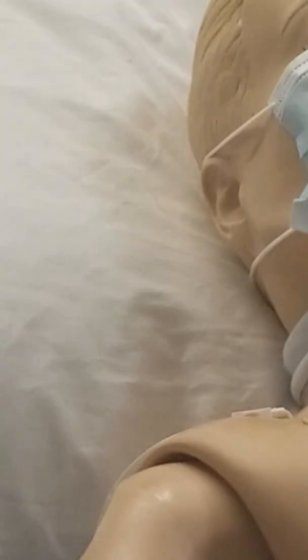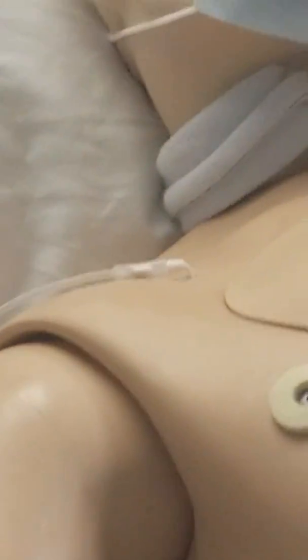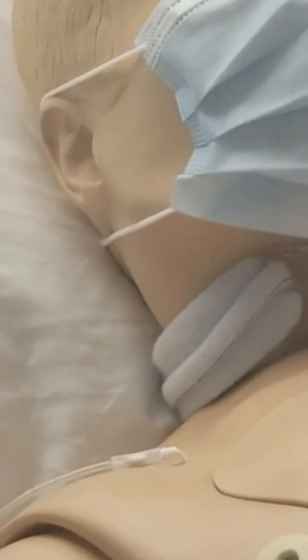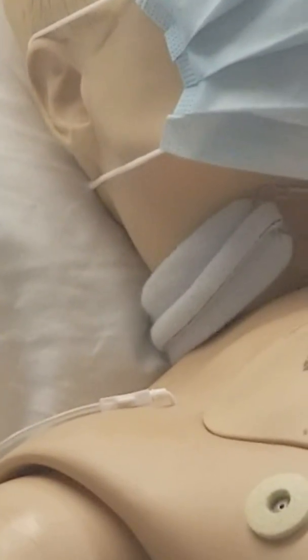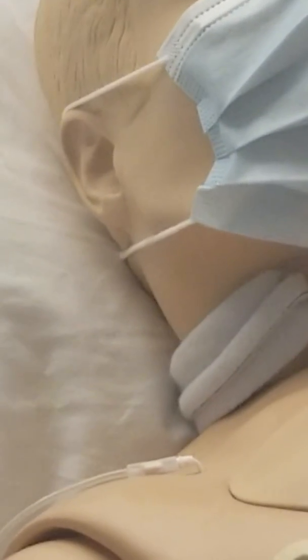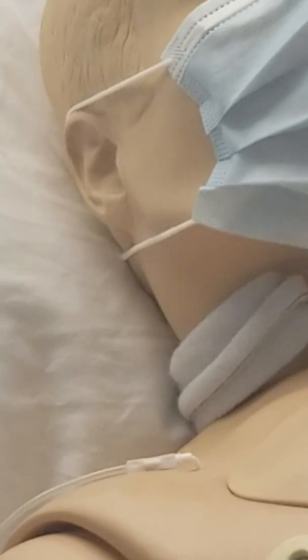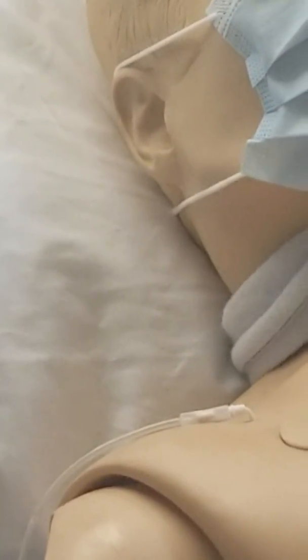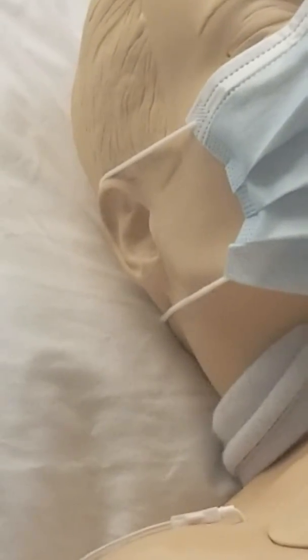Okay, sir, I'm ready to start. Don't go anywhere. So you see what's in your tray, what's available to you. Make sure you get hold of your mask, because you need to put a mask on as well, okay? You cannot sneeze in this man's central line. It's not good. If you have glasses, make sure you adjust your glasses, okay? So your mask, there's a wire up top, and then there's a soft end. The wire goes across your nose.